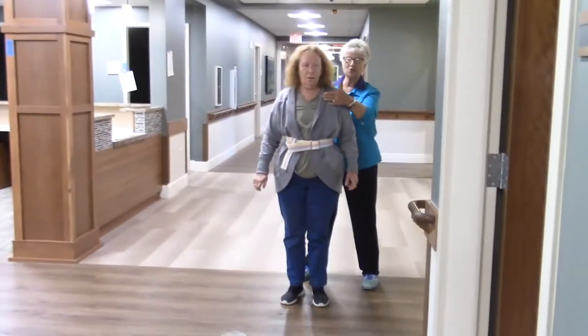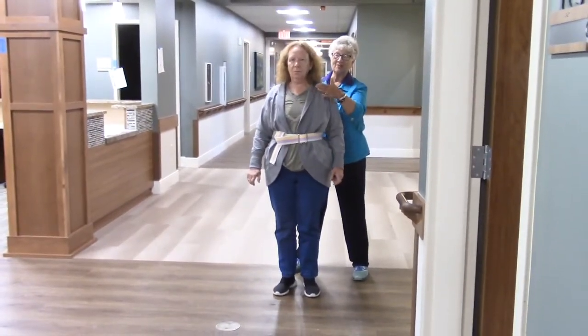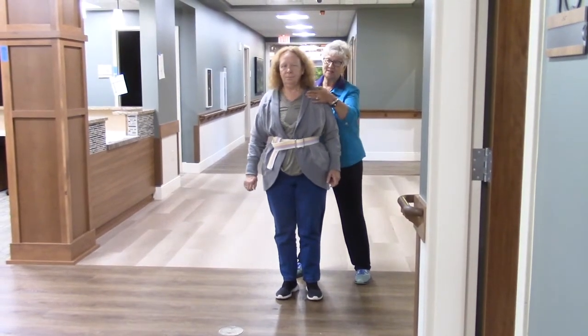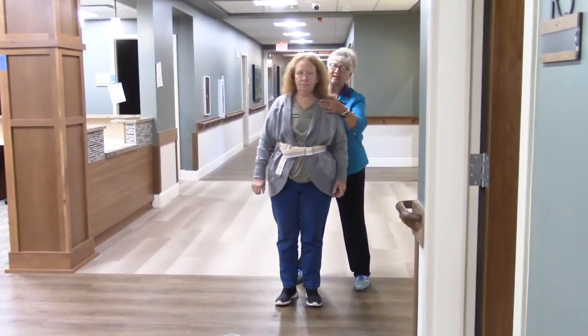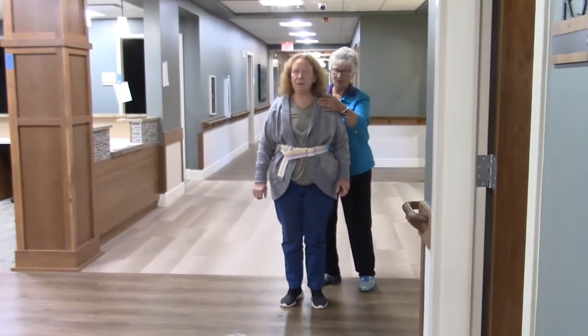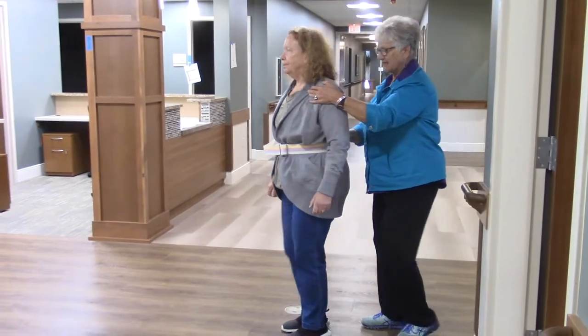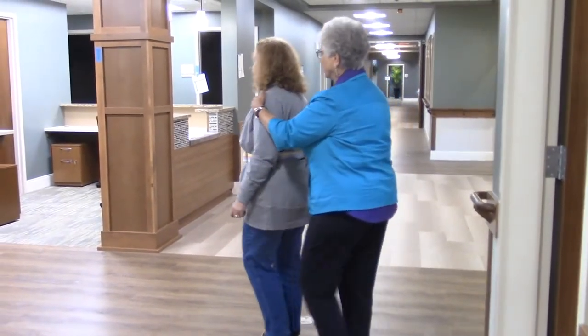Okay, so I pushed you back, Chris, with my hand that was ready to bring balance. See how you can do this and I can still help you? Yes, I feel good. When turning corners, take small steps.